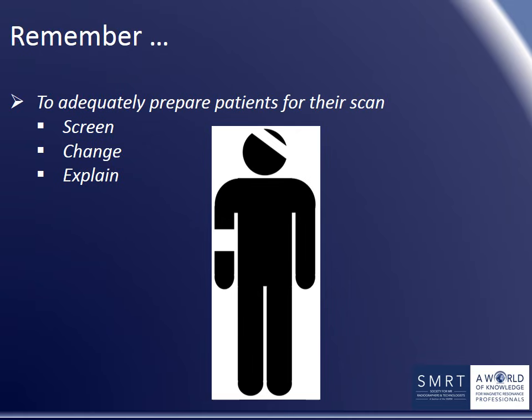Remember to adequately prepare patients for their scan. They must be MRI safety screened, changed out of street clothes into appropriate hospital or clinic clothes free of metallic parts, and the MRI procedure explained to them in a manner that they understand.